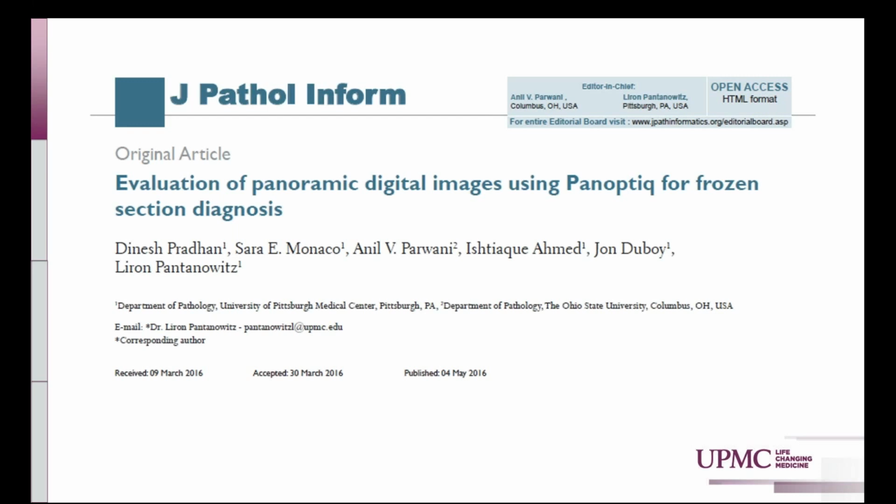The diagnostic concordance to the glass slides, being the gold standard, was 98.3% using the panoramic Panoptiq images and 100% using the whole slide images. The file sizes of the Panoptiq images were more than 14 times smaller than the whole slide images. Time was not ultimately recorded per case, however, the author stated the total scanning time was on the order of several minutes and became progressively quicker with further experience using the system.